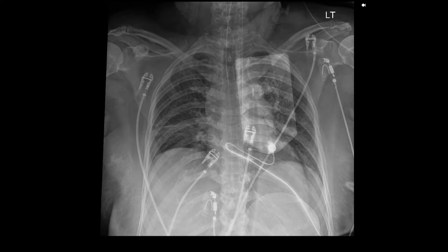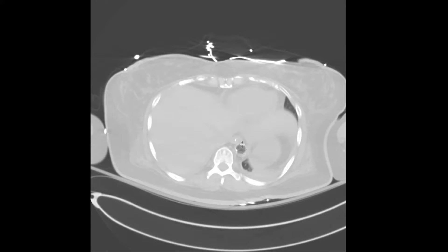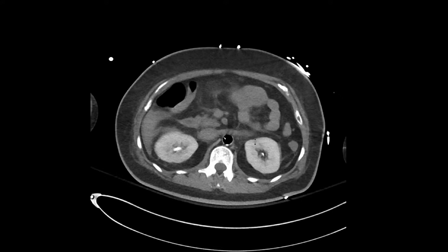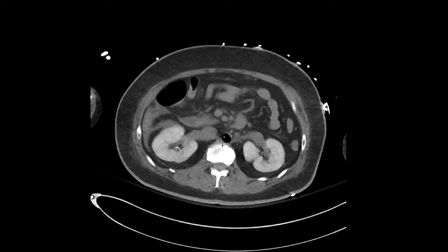Even though the positioning by radiograph may appear acceptable, a balloon can be too long. On abdominal CT, you can see air in the inflated balloon within the aorta — this is normal if imaged during diastole. However, in this case the patient showed delayed nephrograms because the balloon was occluding the origins of the renal arteries. So even though the cranial position was correct, the balloon was too long — something the cardiologist will also monitor for.